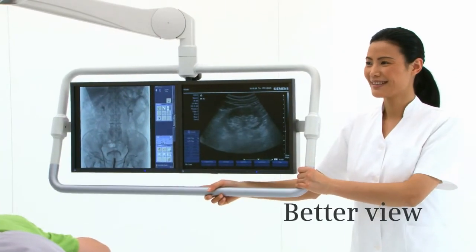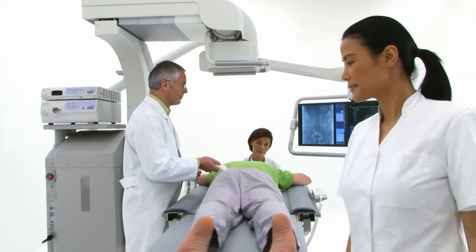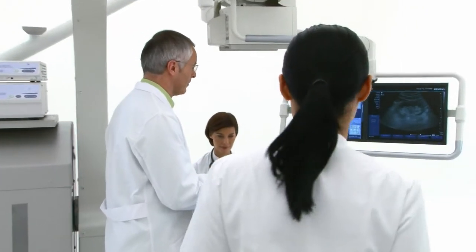Euroscope Omnia offers the latest technology. Its two high-resolution TFT monitors are placed on a spring-articulated swivel arm that allows free positioning.